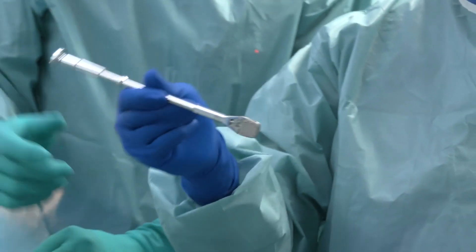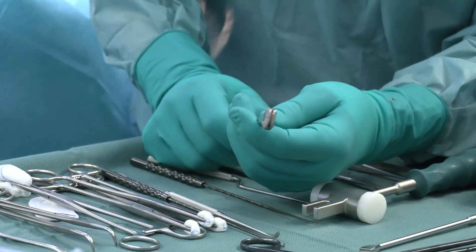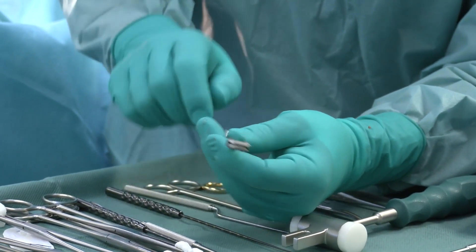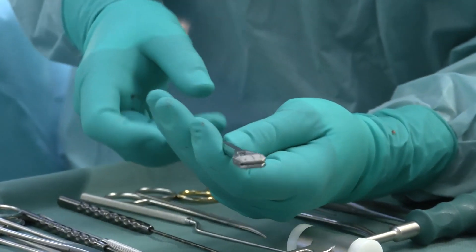You see here the full implant. It's very important that you don't have an angulation between the endplates while inserting it. You have an upper endplate marked with a stripe and a lower endplate — so don't put it in upside down.